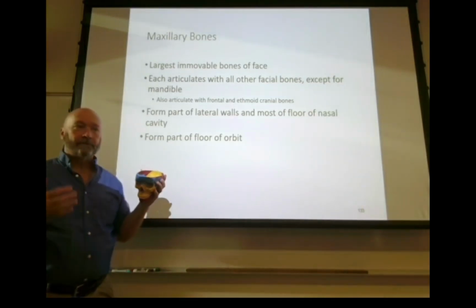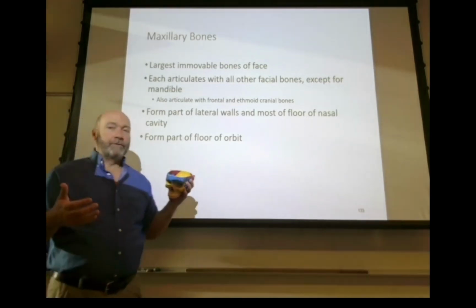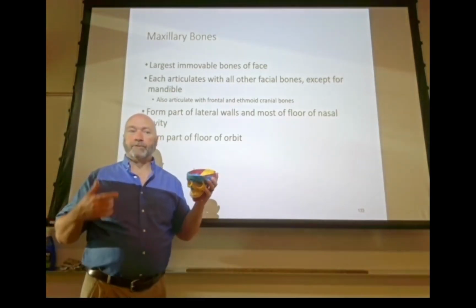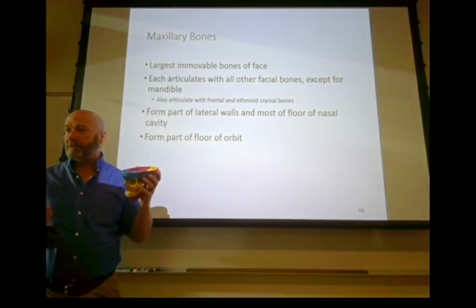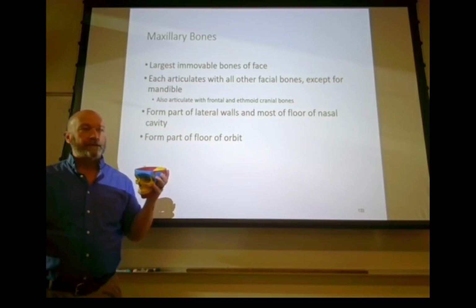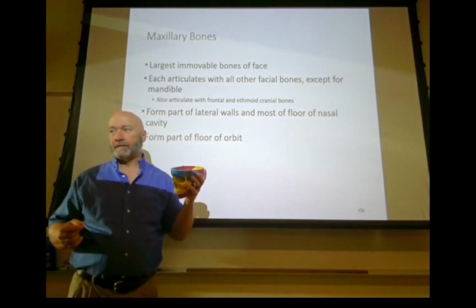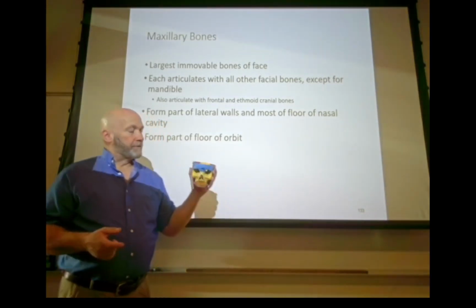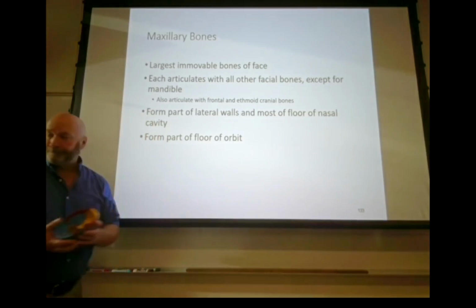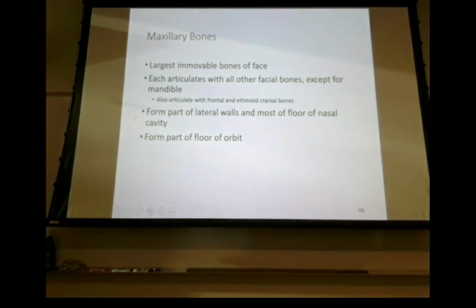One is one view that might show us the fracture itself, and one view that will show us evidence of the fracture. You remember when we were talking about upper and lower extremity, we talked about fat pads in the elbow and the wrist and the ankle and all that. It's kind of like that, only not exactly the same. We can see evidence of a fracture even if we can't see a fracture. Okay, so that's blowout fracture. We'll again talk about that in a bit.